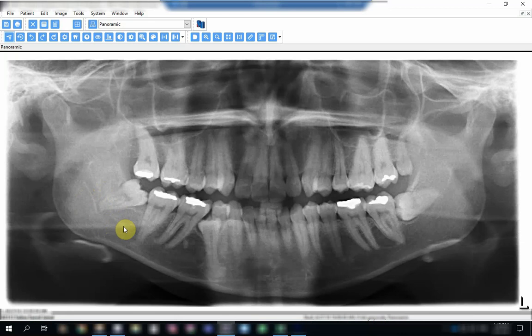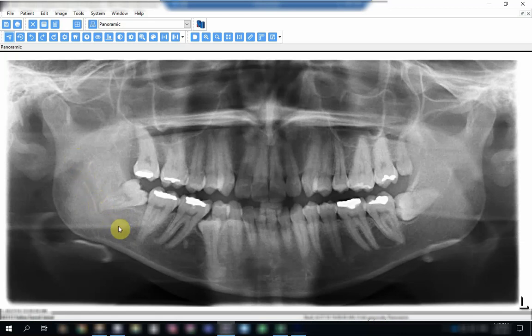If we follow the course of the inferior dental canal, we see that when it reaches close to the apex, there is a change in the course of the canal. It is kind of pushed by the apex of the tooth in an apical direction in this area.